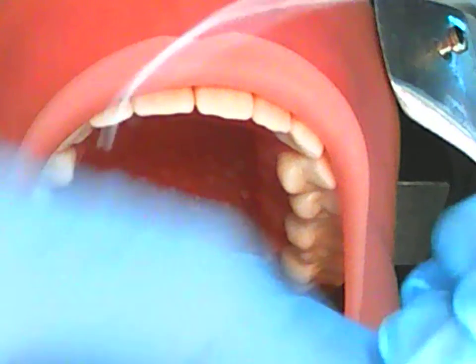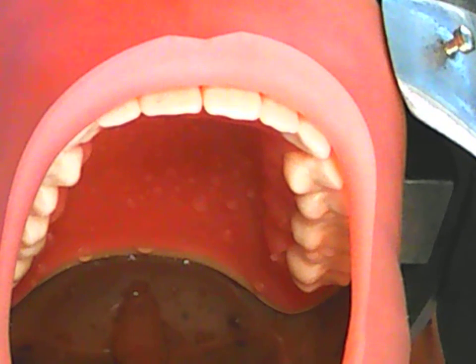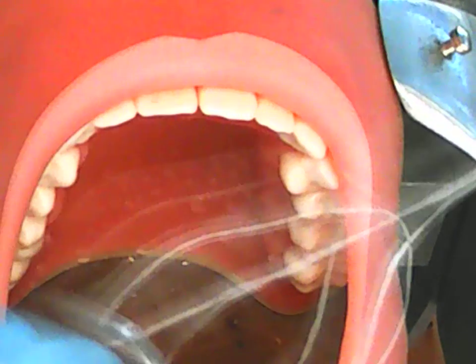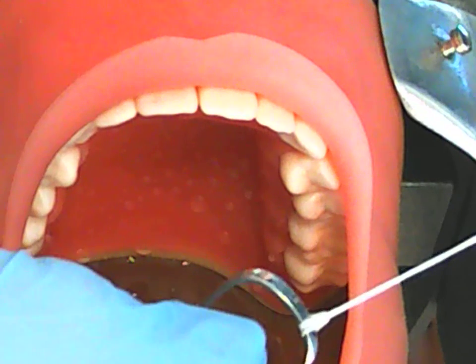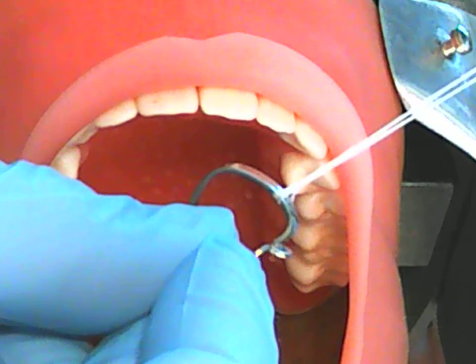Of the floss. And again, I actually feel uncomfortable with it, so I'm going to move away from it and go over my tray because that's my comfort zone. Okay, and I have the knot. I'm just going to pull it nice and tight, and it's secure now around the bow.